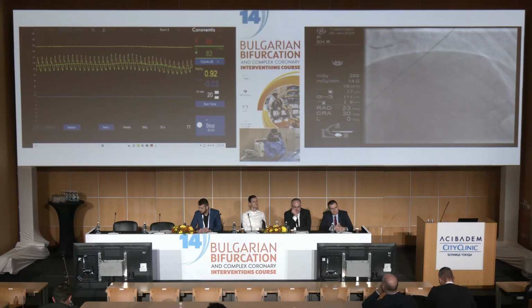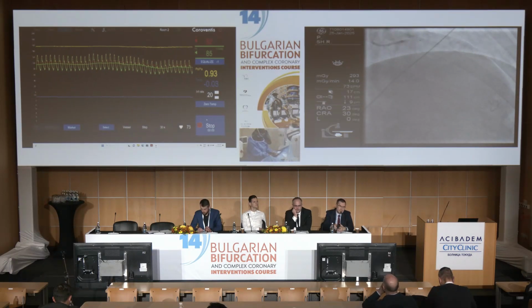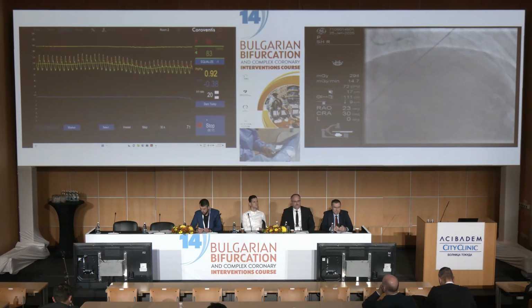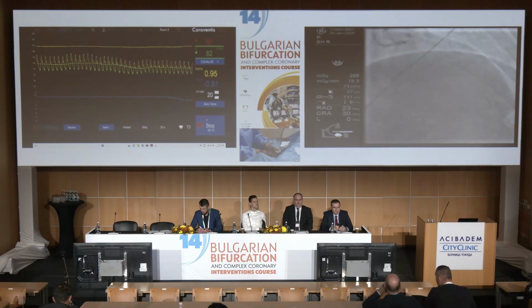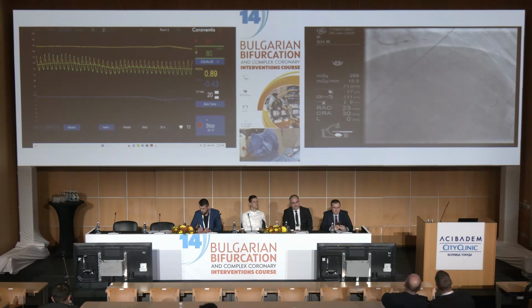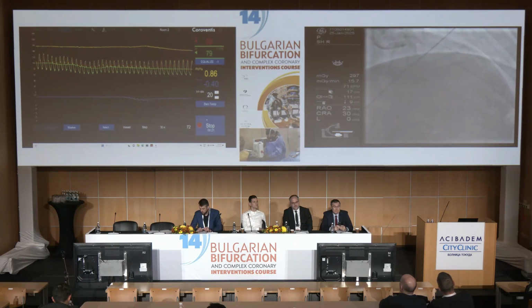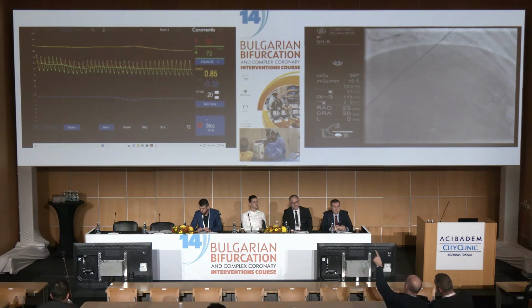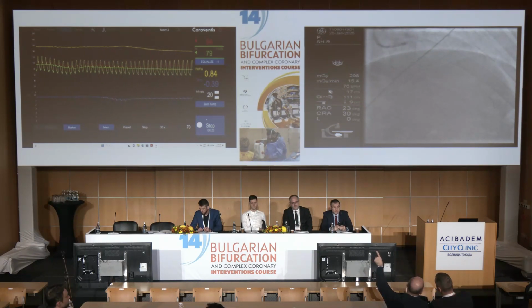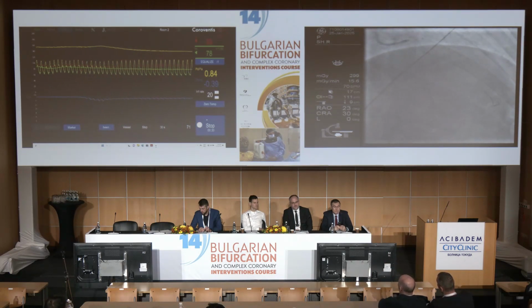Now, you can advance the reflow 1 millimeter or 2. We are infusing now. Yeah, that's fine. And you see that the temperature decreases much more than before. You also see that the PDPA changes. Changes to what? To 0.84. It will probably decline even a little bit more.